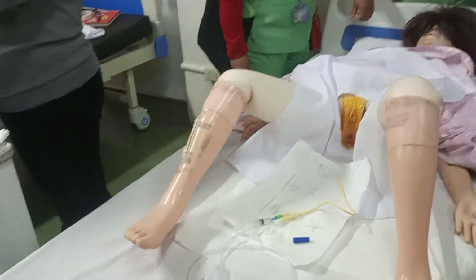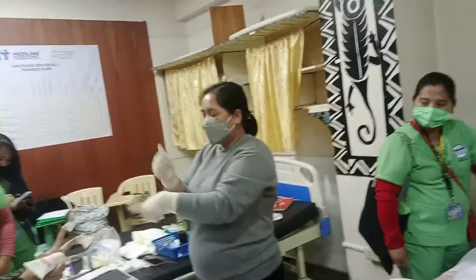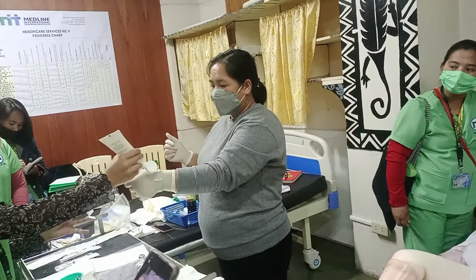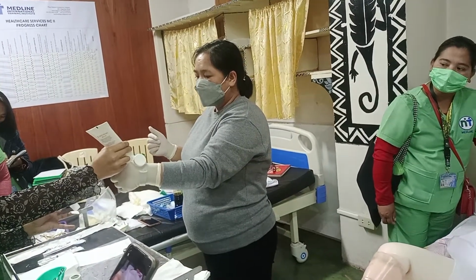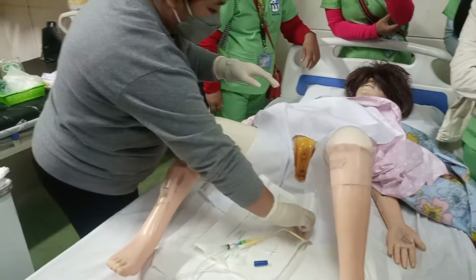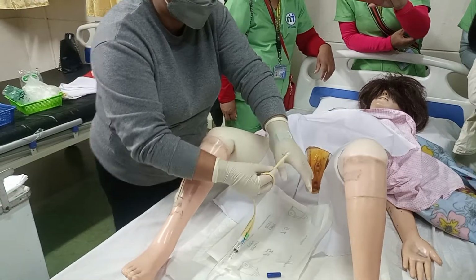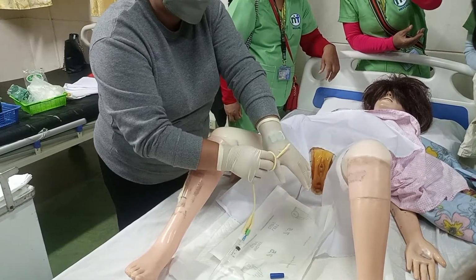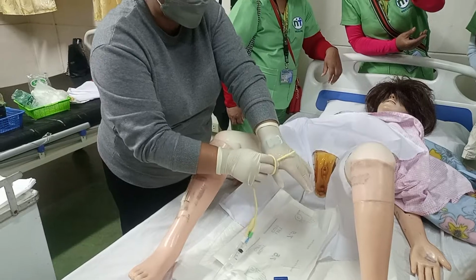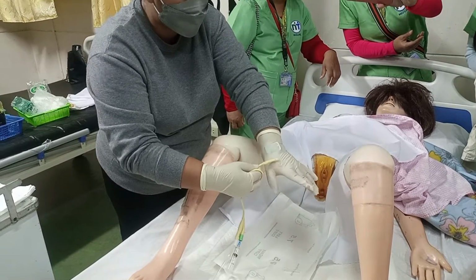Ma'am, palagyan naman ako ng lubricating jelly. Itutok mo lang, ma'am. Do not let the bottle touch my sterile gloves. Okay? So there, i-roll ninyo yung catheter para medyo tumayo. Now, you're going to lubricate at least 2 inches, no? Para hindi masyadong masakit para sa patient.